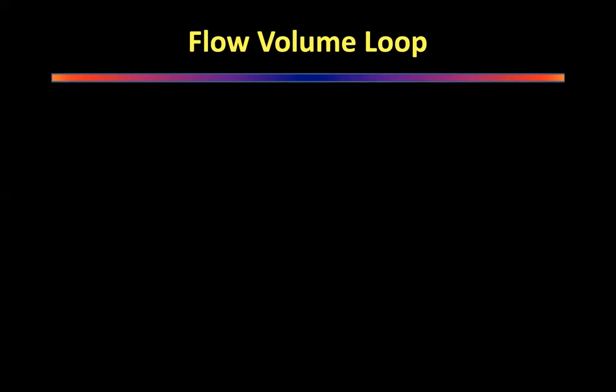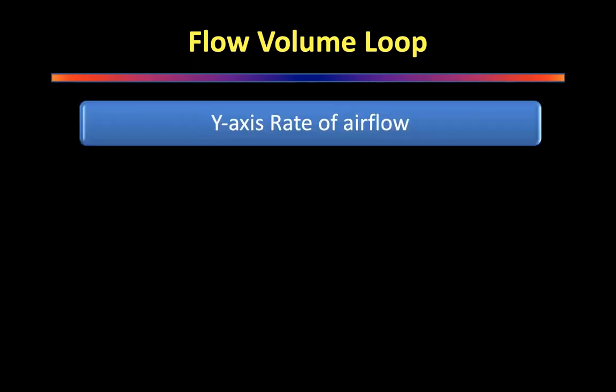Get your pen and paper out, because this is the most important one. That is the flow volume loop. How do you draw a flow volume loop? I was personally asked to draw a flow volume loop in my FRCS exam. On the viva table, the examiner gave me a paper and said, draw me a flow volume loop of XYZ. He asked me three or four and I could draw them. So it's important to learn how to draw this.